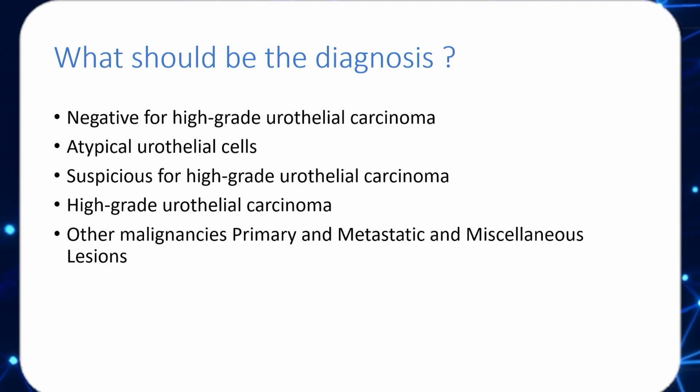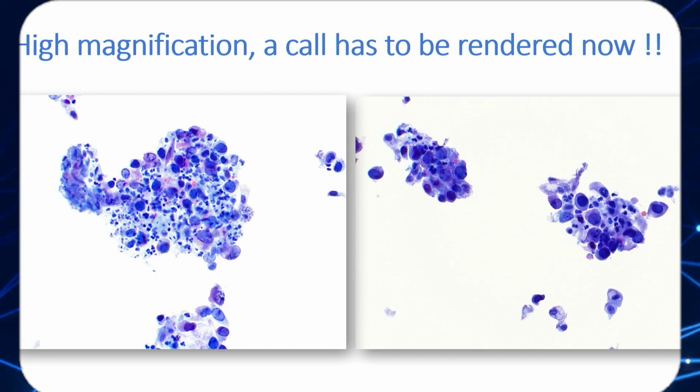So this is the categorization. Show of hands, who thinks this is negative for high grade? Atypical? High grade urothelial carcinoma. No one's agreeing to high grade? Or is this something else? No. No history. No radiation.